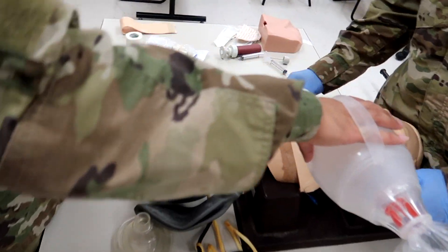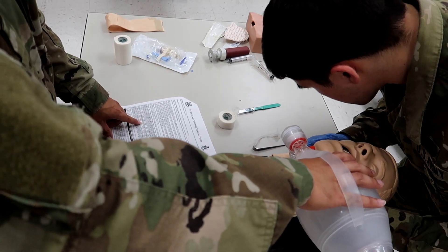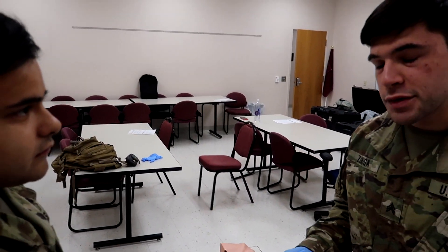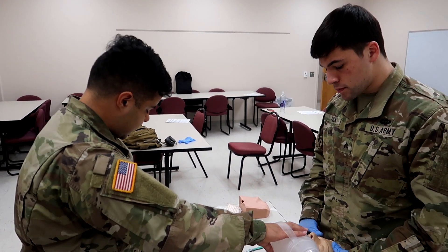He will assess the casualty for spontaneous respirations for 10 seconds. The evaluator will ask, 'When would you assist a casualty with ventilations?' If the respirations were below 8 or above 30, or if their pulse oximetry is below 90%.